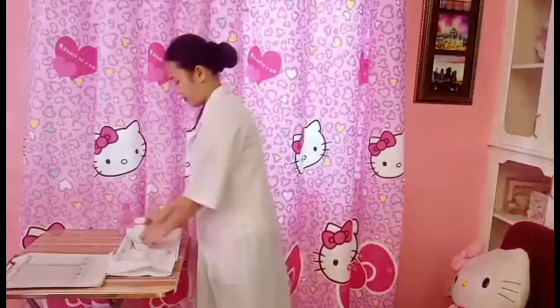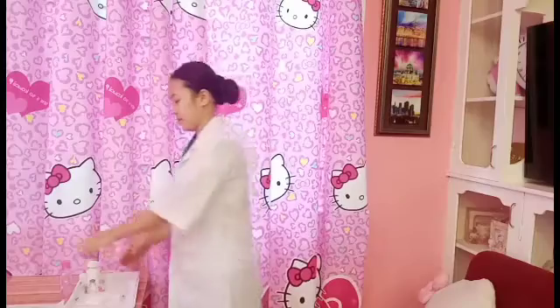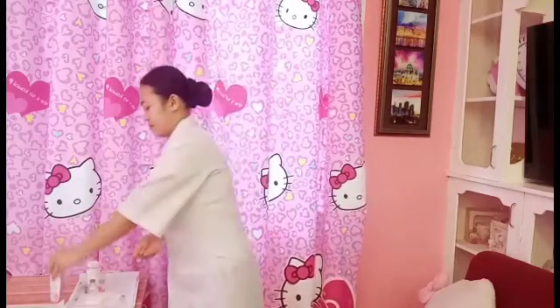Next is to organize equipment, because organizing equipment will provide a smooth procedure and easy access to the equipment needed. For the implementation, perform hand hygiene and observe infection control procedure. This is for infection control. Prepare the medication from the vial or ampule for drug withdrawal.